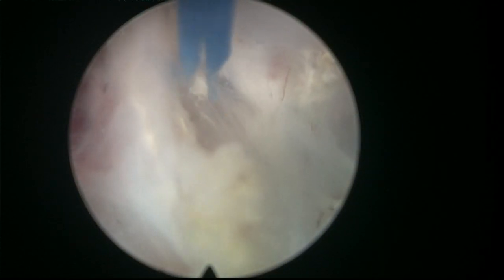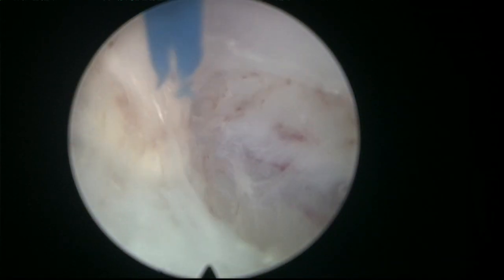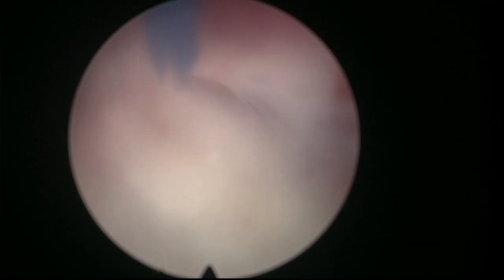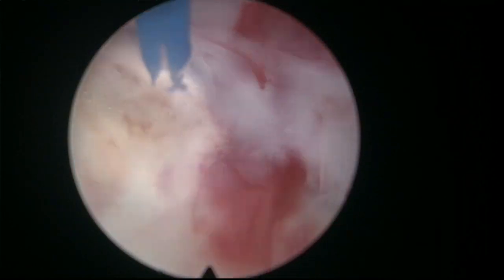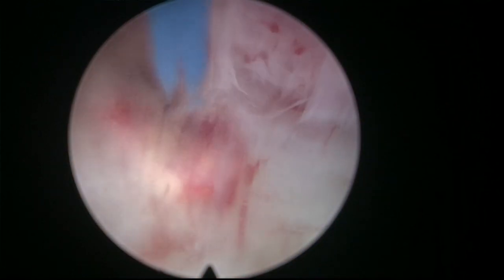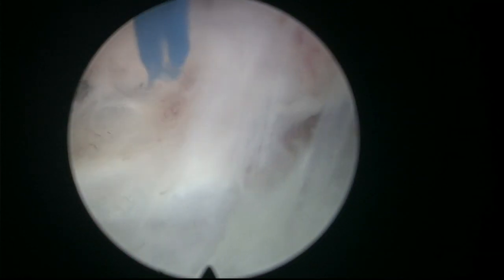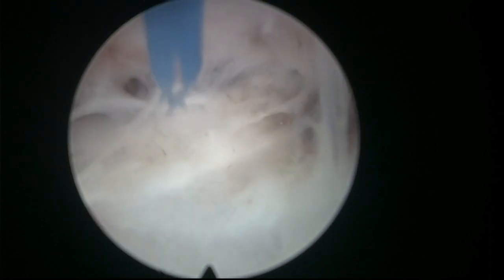Remember to try to do relatively wide movements, huh? Because if you go a little bit fast, the speed of dissection provides a very nice detachment of the adenoma, but also very safe. You see that you can find a working distance that produces this effect of opening the plane and giving you some hemostasis of the remaining tissue.